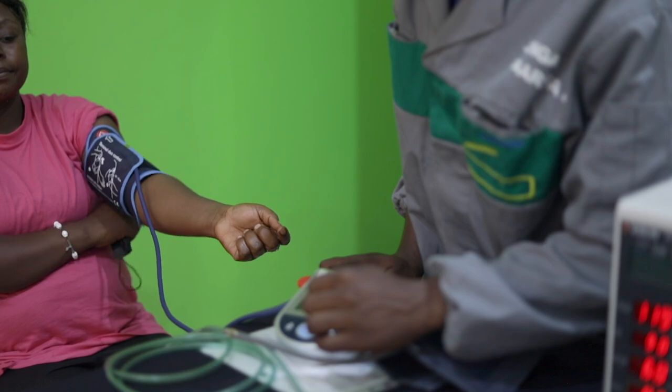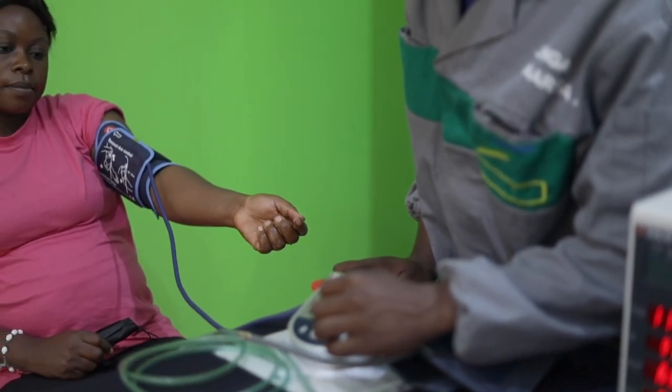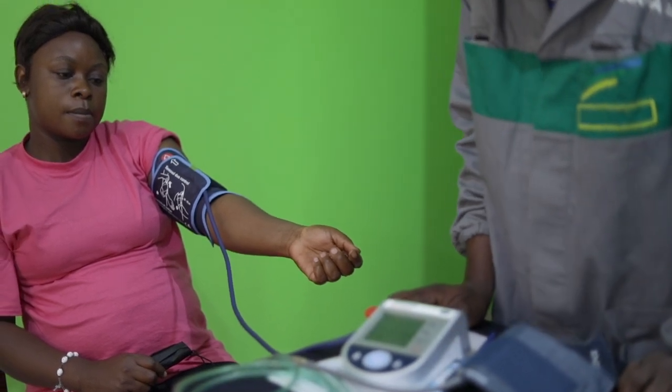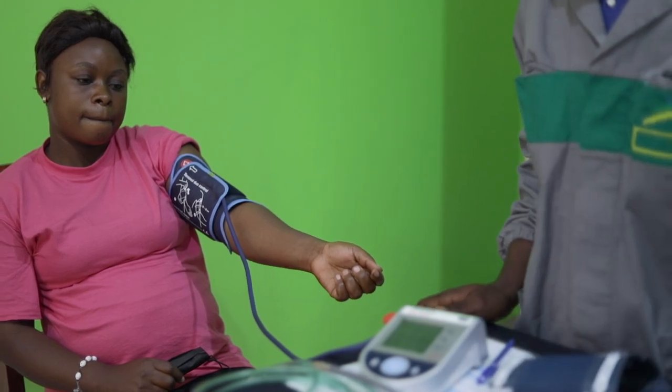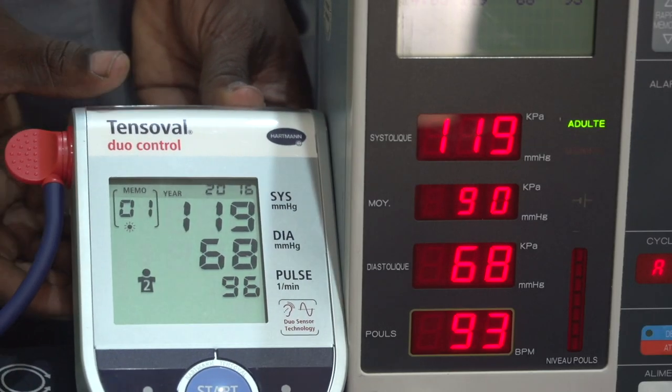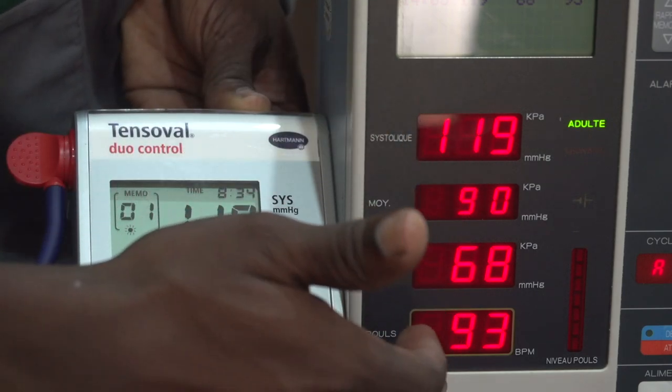Dans un second temps, on va prendre des mesures comparatives, en montrant deux méthodes. Première méthode : avec un appareil avec un module PNI testé et fonctionnel. Comme précédemment, on mesure les valeurs des pressions artérielles et on les note sur le compte-rendu du test.